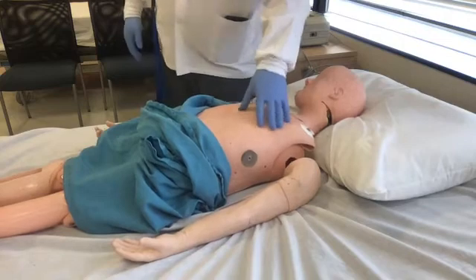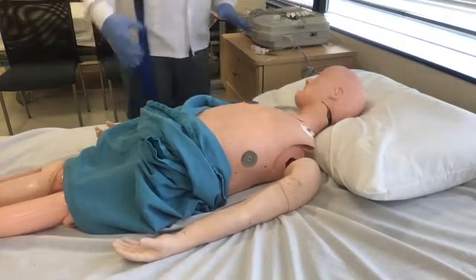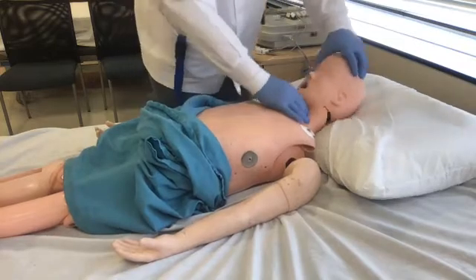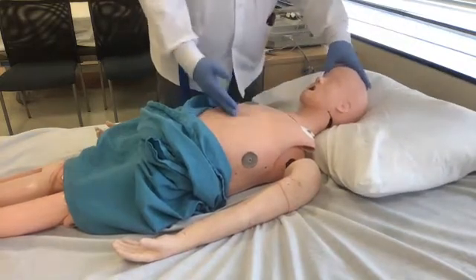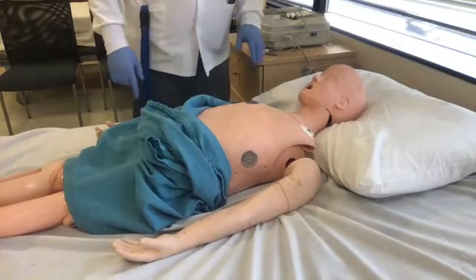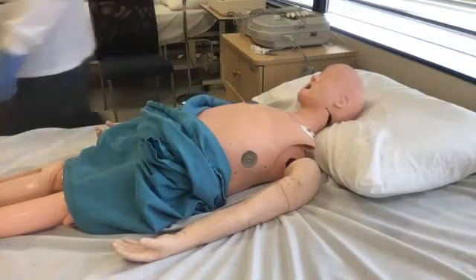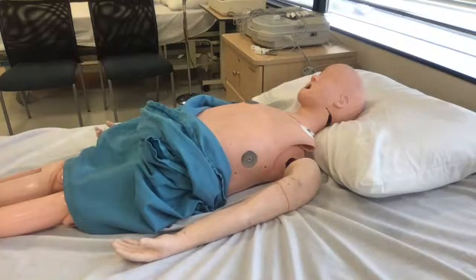So I'm going to show you the most correct way to do this. And the most correct way is, remember that little picture that I showed you guys? And yes, I'm going to be like that tech, and we're going to talk about the picture. But we're not going to do a picture because we're going to actually measure, because your chest is different from yours is different from mine, right? So it's all different.